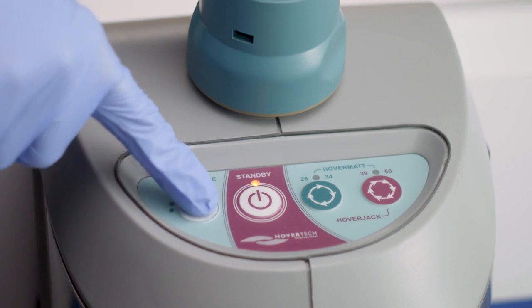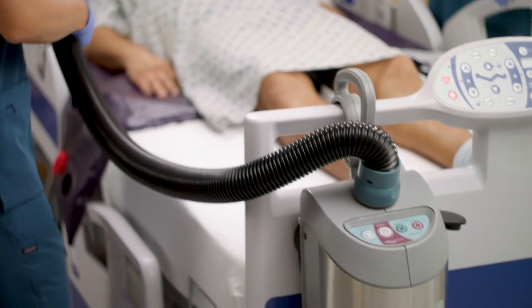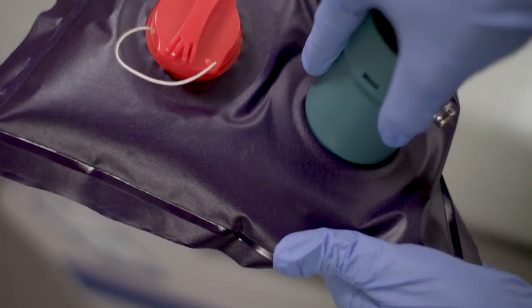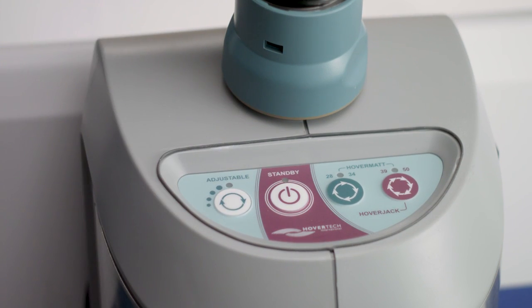Press the adjustable button on the air supply to initiate airflow. Locate the inflate valve that is positioned on the opposite side of the turn direction and place the air supply hose over the valve. If necessary, you may press the button up to three more times to increase airflow.